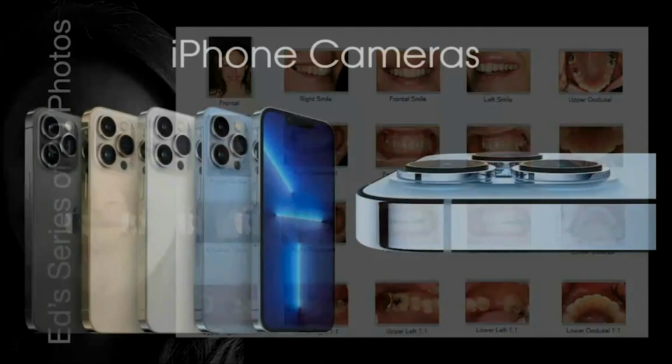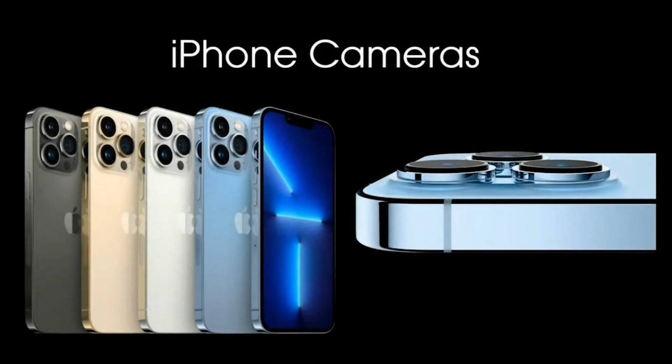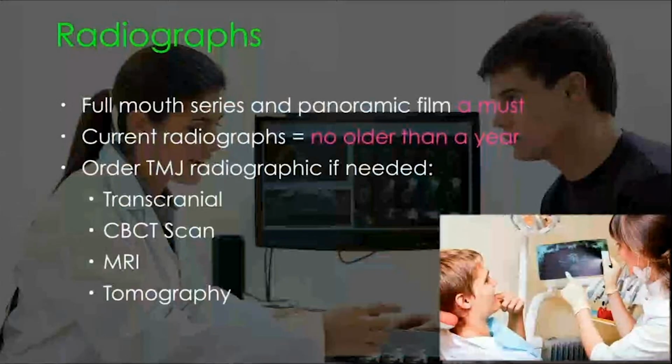All right. And for those who don't have a digital single lens reflex or SLR or a mirrorless camera, almost everyone I know has an iPhone. These iPhone cameras are pretty good these days. So a lot of the Invisalign cases are being taken with iPhone cameras, and there's a lot of things that you can attach to an iPhone camera to use for lighting, and they take amazing pictures. So you can't say you don't have a camera in the office because somebody will own an iPhone. Radiographs are a must. So, full mouth series and panoramic films are a must.